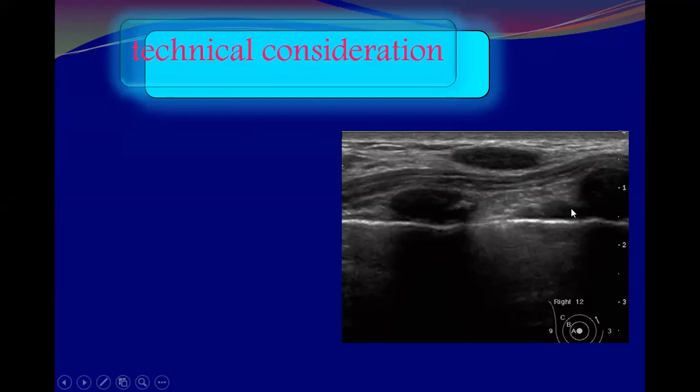Representing what? Yes, you are right. The junction of the. You are right. These are pseudo lesions. Yes, these are costal cartilage, costochondral junction, or rib shadow. Okay, and why? Because this is a muscle. Excellent. You mentioned that this is above.